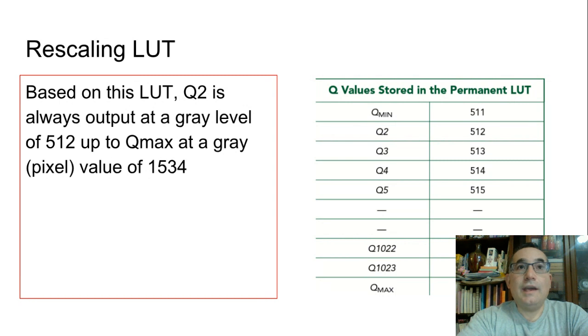And that is going to take our pixels and their brightness levels and convert that to what is believed to be, based on research and the things that we've been talking about, the optimal contrast level and brightness level for that particular type of exam.